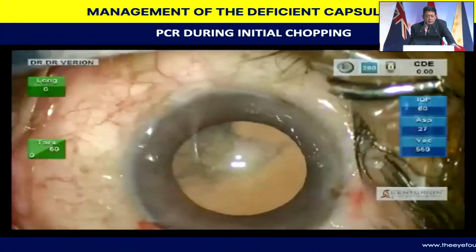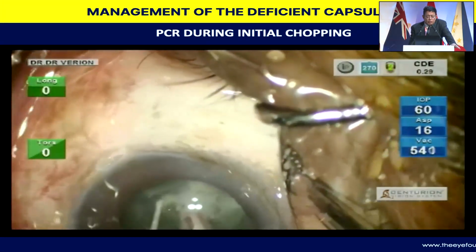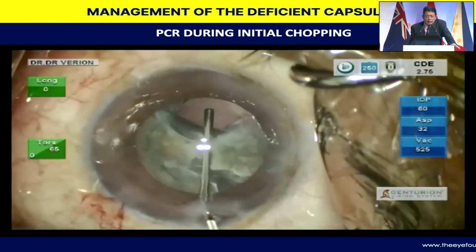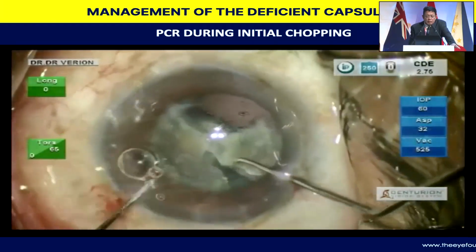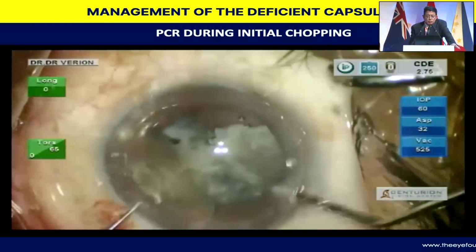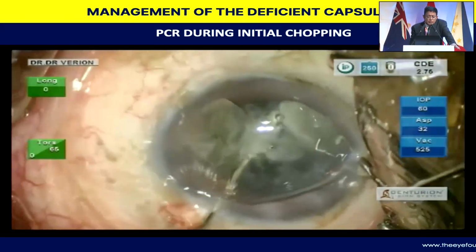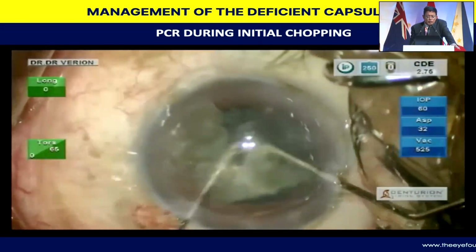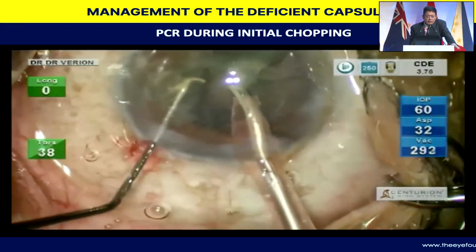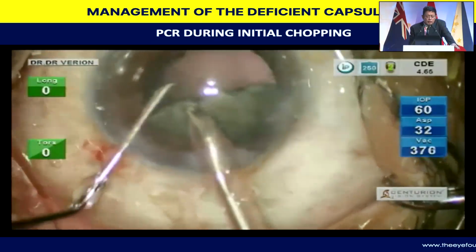And what about PCR during initial chopping itself? This again is a fairly routine case, a walk in the park case. But what I noticed during my surgery, here I have a PC rent, and what I do is to immediately tamponade the anterior vitreous face with the dispersive viscoelastic, bring whatever nucleus fragments are there into the anterior chamber, and then with adequate covering of the endothelium, I go ahead and remove the nucleus fragments over there.